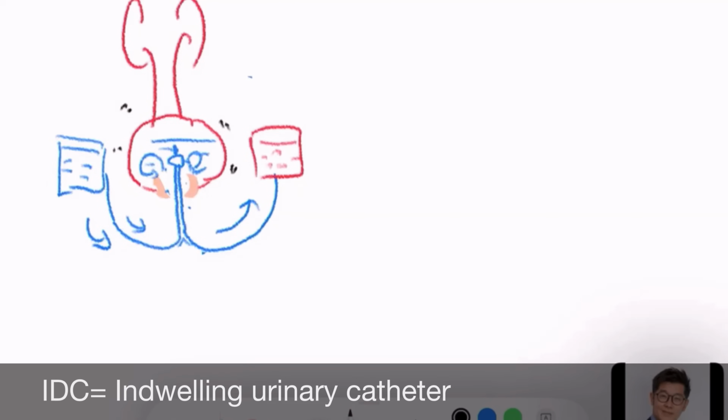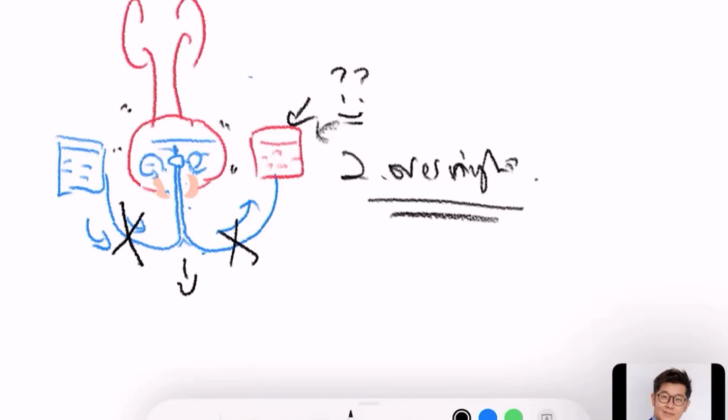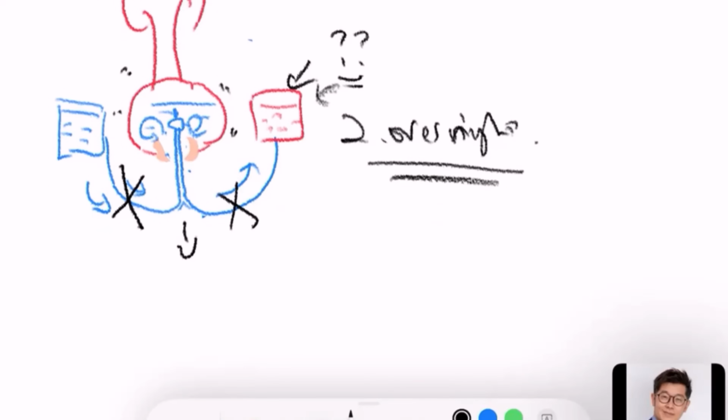How long do you need to keep this? This bag usually stays for a total of 2 days. On the day after the surgery, I will come in the morning and look at the color of this and decide. If I see a nice slightly pink color or a totally white color, everything is a-okay. I'll stop the inflow and let you drink and eat normally, and continue to observe until the next morning. If everything still remains nice and clean, I will remove the entire tube. By then you would have stayed 2 nights in the hospital, and you will be pretty much ready to go home after that.